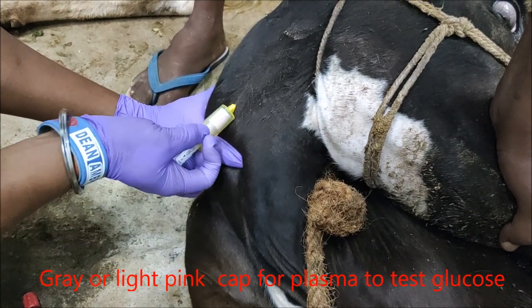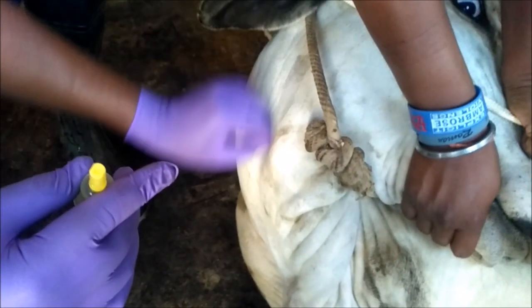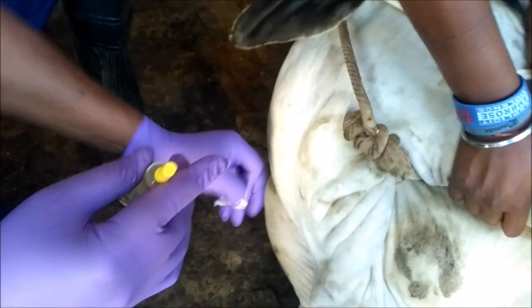Once you collect the blood, ensure that the punctured part does not bleed, and try to sterilize that area.